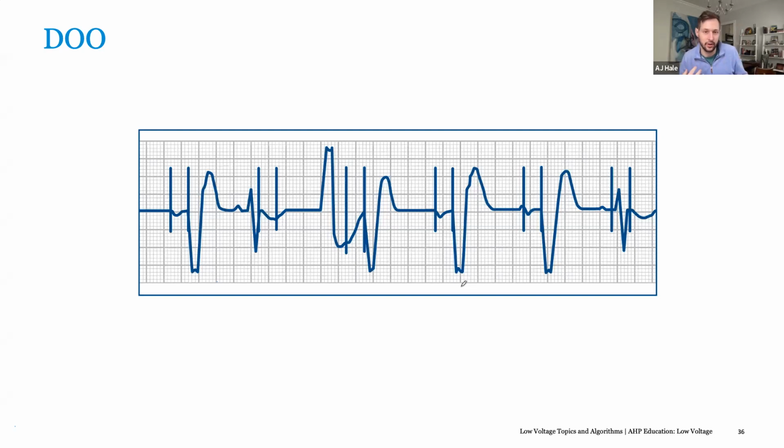I've only ever heard it called a VDD lead. I know it has a model number, but I don't know it. Never seen it. In the UK, sorry AJ, Medtronic call it a single pass lead. It's not something a lot of people tend to do because it has a habit of falling out.